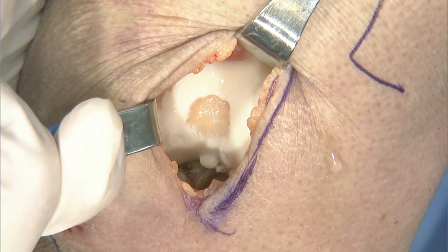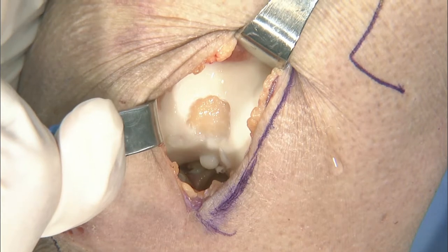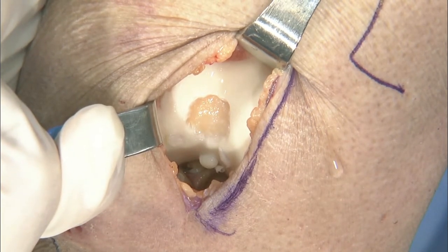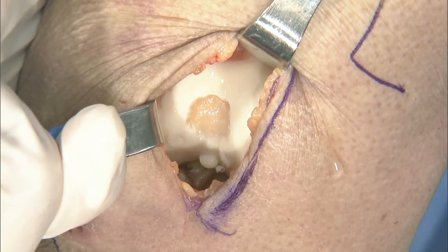Yeah, I think that point of expressing it first outside the defect is crucial, and you can't forget that when you go back to put it on top to do it again, because it'll just put it all over the place. Right. So now basically we're going to bring our implant up to the knee.